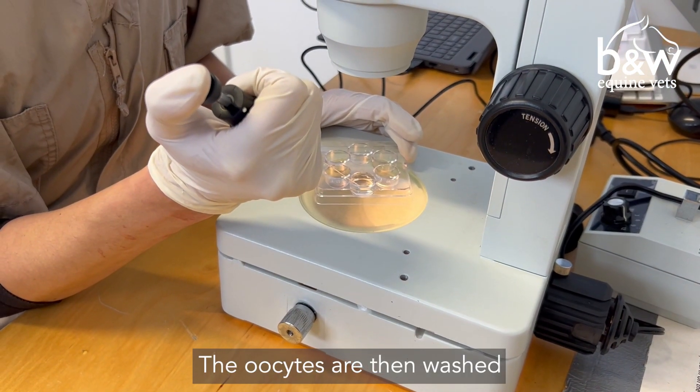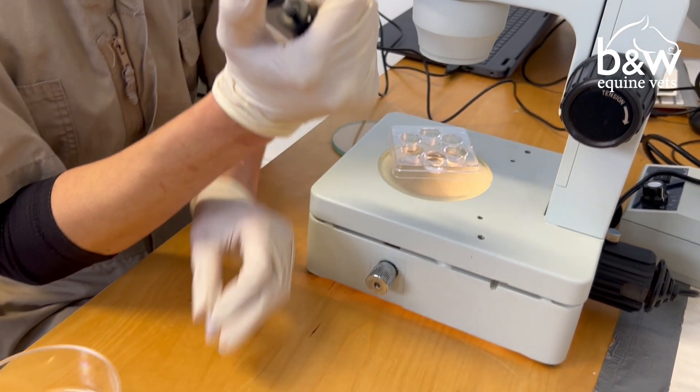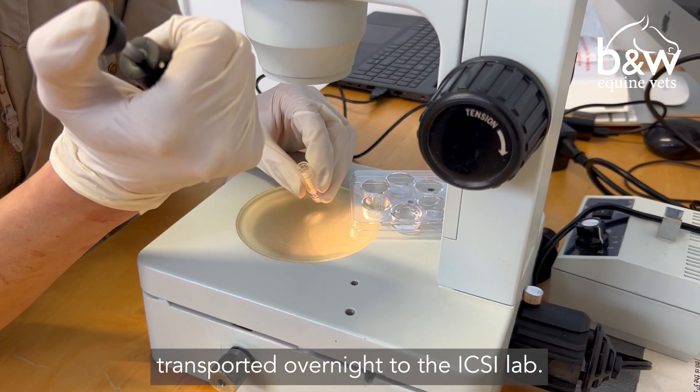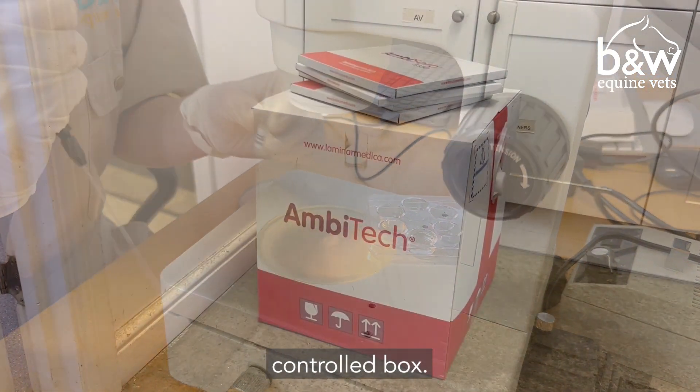The oocytes are then washed and packaged into small vials, which are then transported overnight to the ICSI lab in a temperature-controlled box.